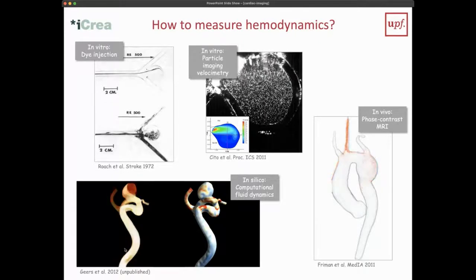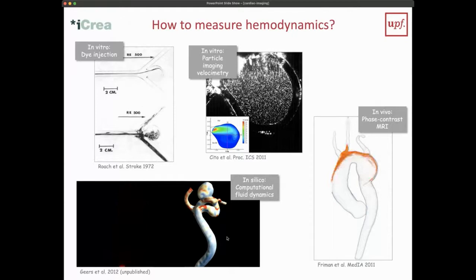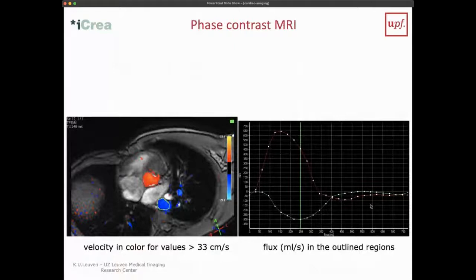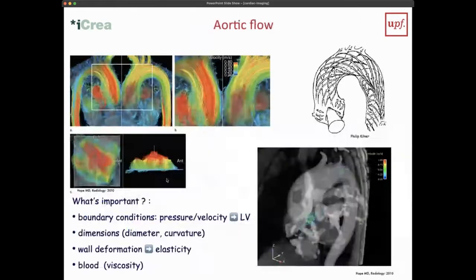For example, when we look at blood vessels, this is actually a simulated flow, but looking at flow within vessels or within aneurysms or within aortas with enlargements, that's actually something which is very, very relevant. And so we can either do MRI imaging and then measure Doppler-like signals, so we can do velocities as a function of time, with, as I said before, much less temporal resolution than Doppler, but much better spatial resolution and localization than Doppler. So you have advantages, disadvantages.